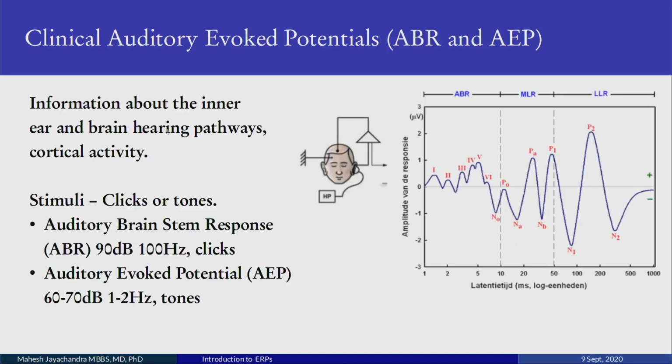Right. So in the middle you see a typical circuit where you have recording electrodes, one on the top, one here, and there's a ground, and you hear the sound, and the sound is given by an HP click or tone generator, and you get recordings like these.